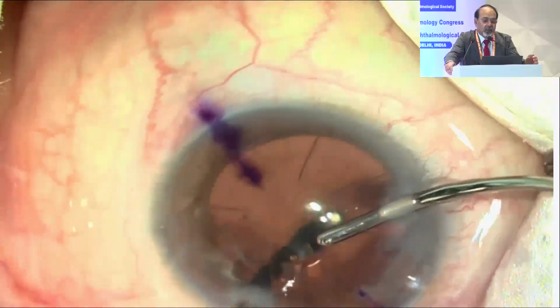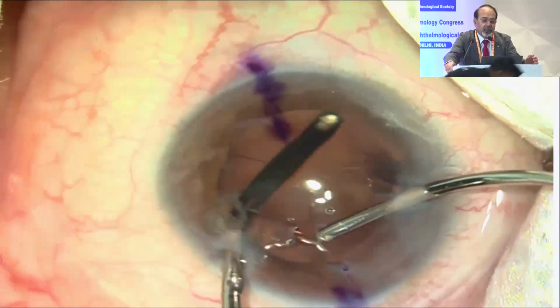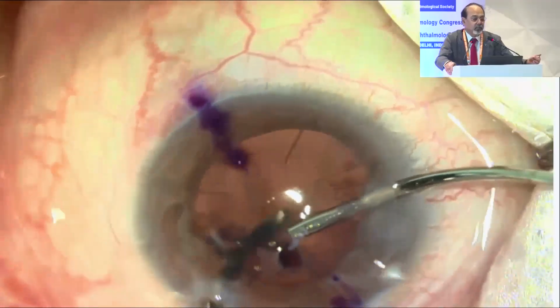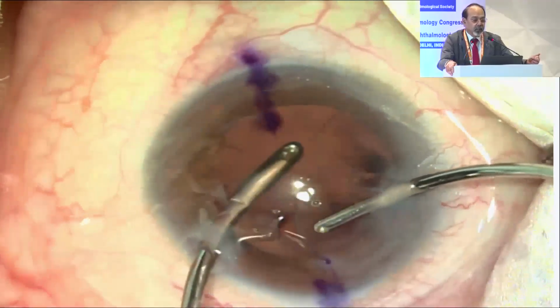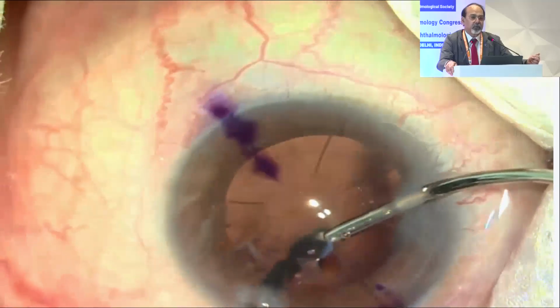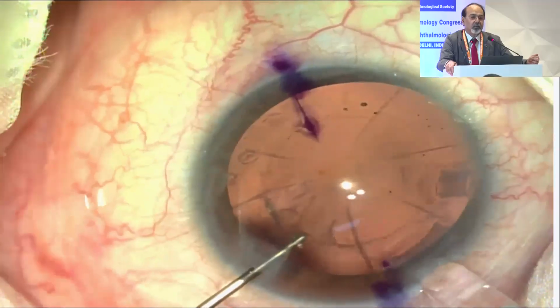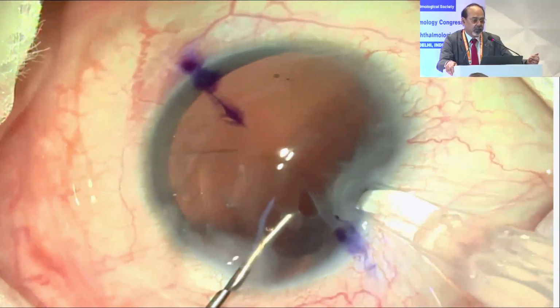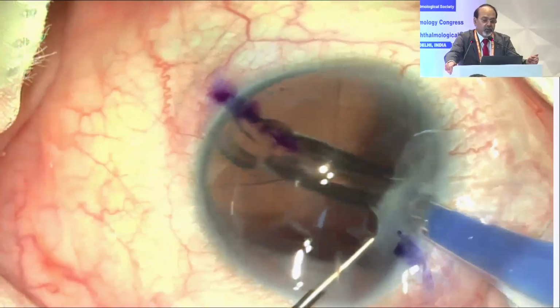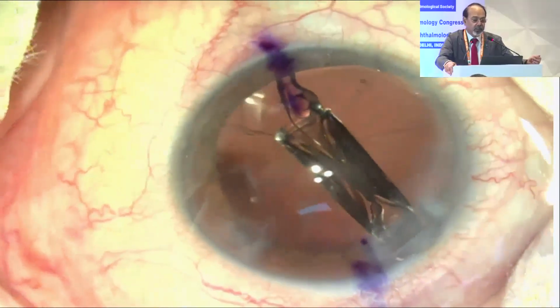It's very easy to remove all this cortex and polish the posterior capsule, which is very, very important, because if you are left with some cells, then you will have posterior capsular opacification, and when you do a YAG, there is a possibility of CME after that.